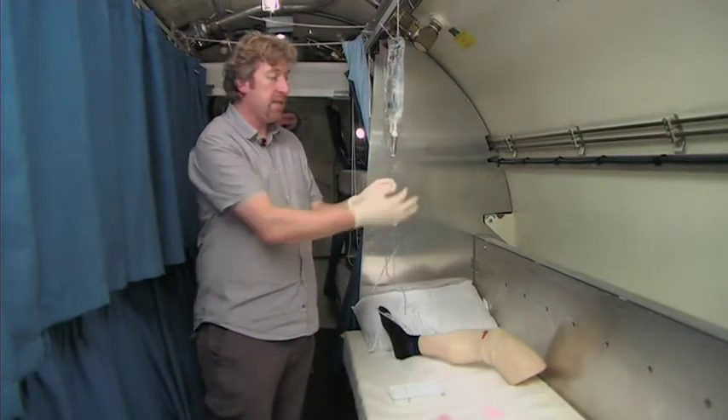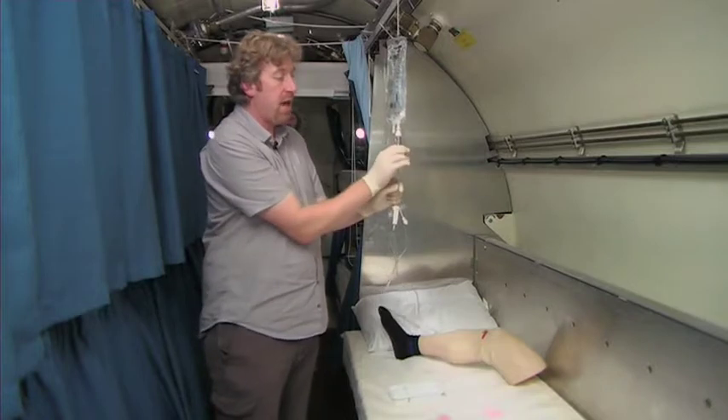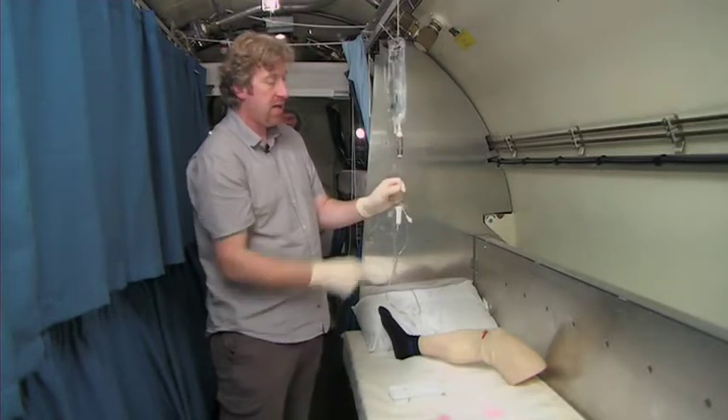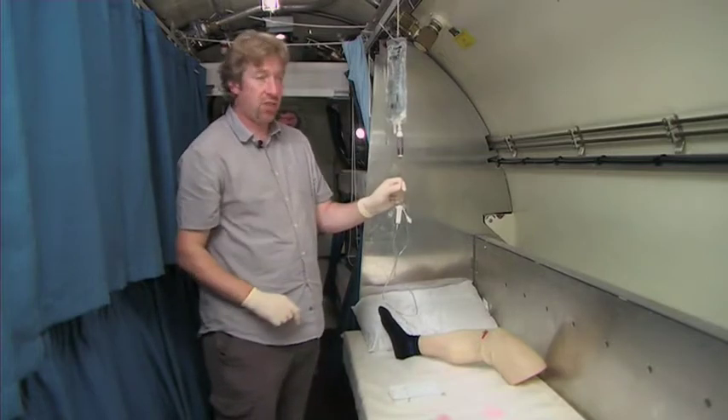What we then need to do is fill up the drip chamber. You just gently pinch together, release, and you see a volume of fluid enters the chamber.